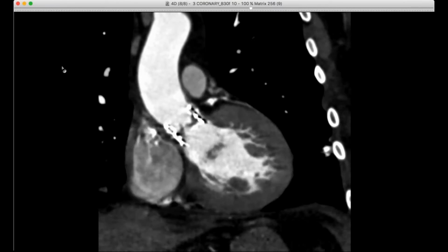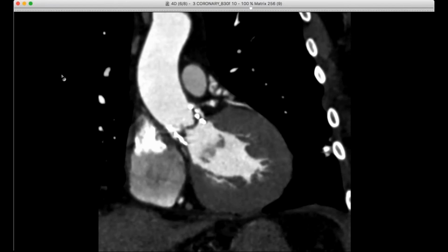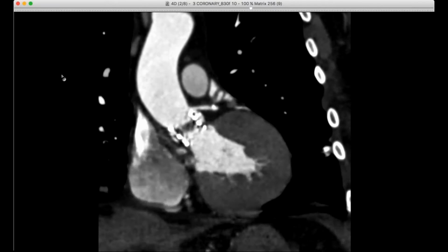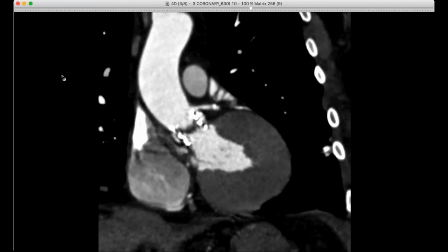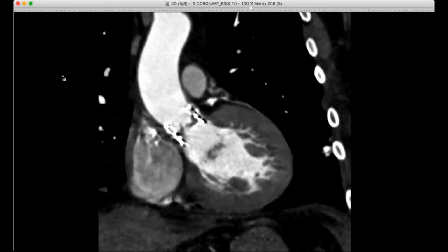So Brent, what do they do with these if the valve is like in this case? Well, it's unclear. Some are trying anticoagulation to see what's going to happen. I presume that in this particular case, we're going to get follow-up to see if this decreases with treatment. But the treatment so far is unclear because I think no one really has much experience with doing these gated studies soon after TAVI, and of course, echo can be problematic because you can't see the leaflets very well, and so most of these cases are referred for gated CT because theoretically you should be able to see the leaflets better than echo.